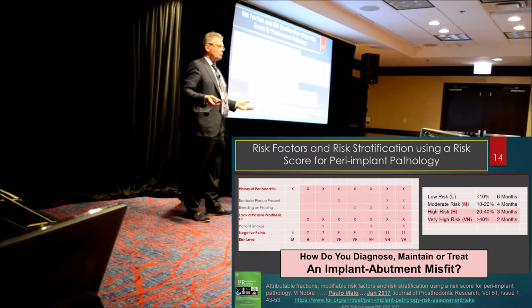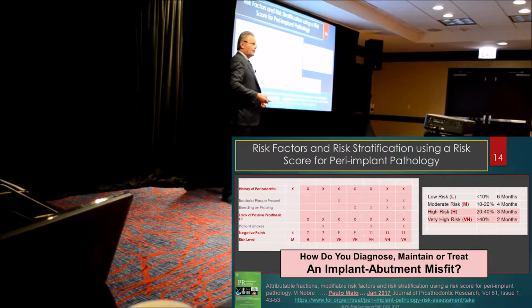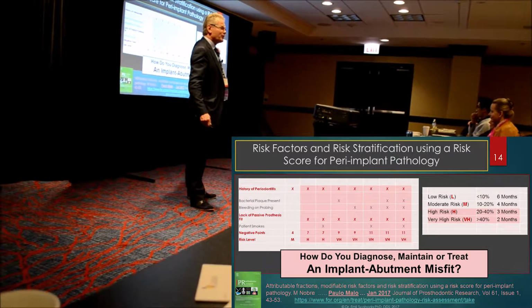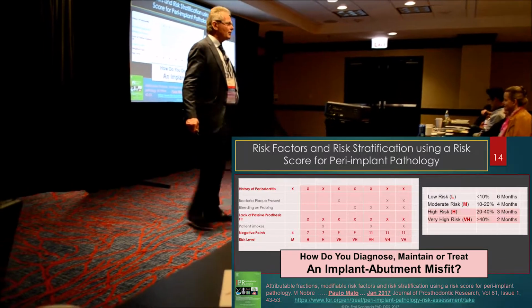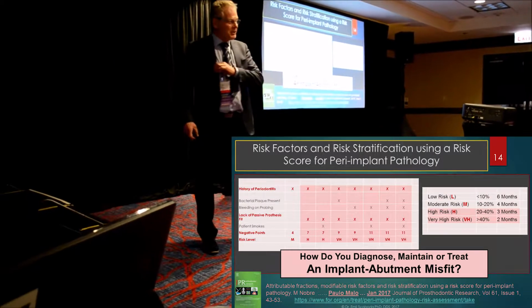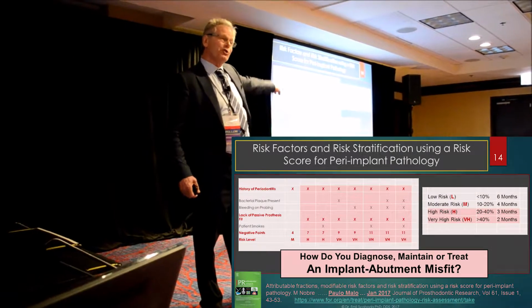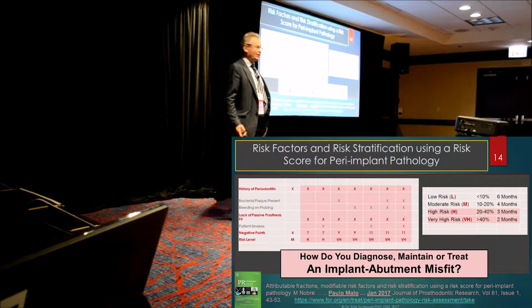And the problem is, we have no way of diagnosing this problem. And guess what? How do you clean an implant abutment misfit? I don't care if you clean this person every day, you're not going to clean the misfit, the macro gap. You can't do it. It's a blind alley. Once you create this problem, you cannot recover. Even if you took the prosthesis out, threw it in the garbage and made another one, if you're going to screw it in again, you're going to screw it up again. You see? And that's, I'm sorry, that's what it is.